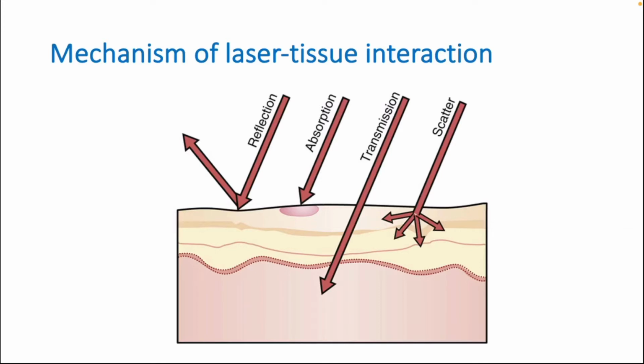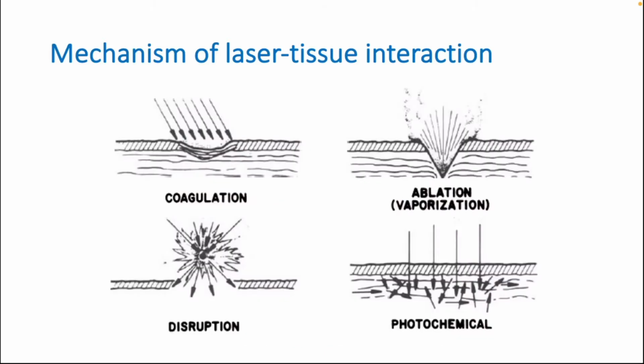Several laser tissue interactions have been observed, mainly coagulation, which is when the laser hits the tissue at a normal body temperature of 37 centigrade and heats it to over 60 centigrade, which coagulates the blood and stops oozing at the ablated tissue margins, like in incision and excision procedures, for example. Photovaporization is the second interaction between laser and tissue. When a high energy, highly focused laser hits the tissue, it produces a surface temperature exceeding 100 centigrade, which causes tissue vaporization.